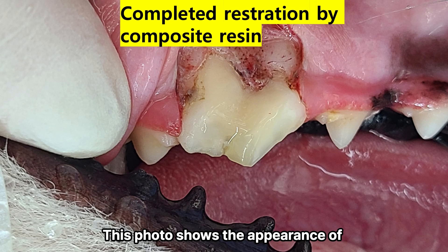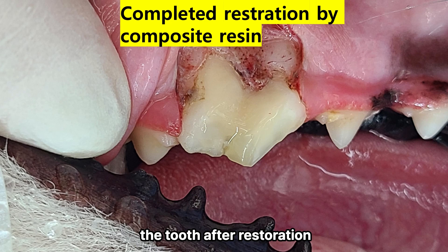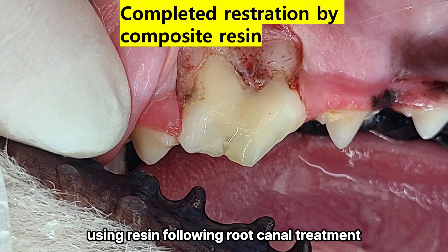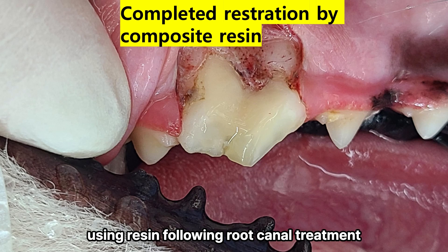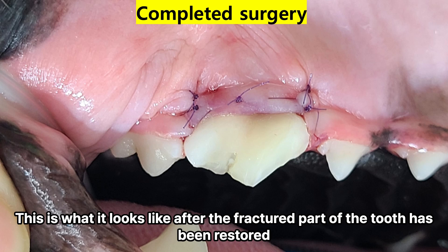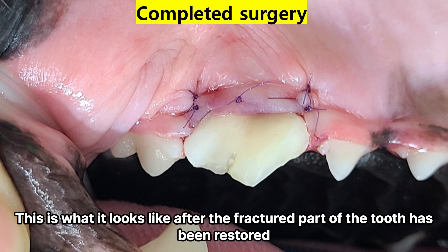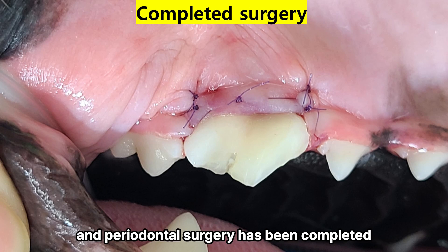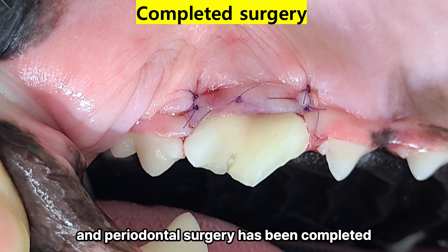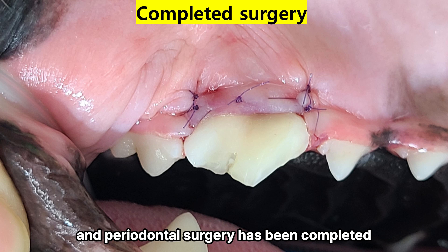This photo shows the appearance of the tooth after restoration using resin following root canal treatment. This is what it looks like after the fractured part of the tooth has been restored and periodontal surgery has been completed. Thank you.